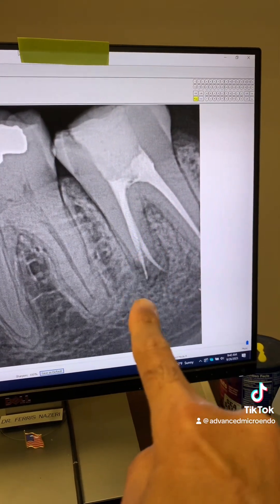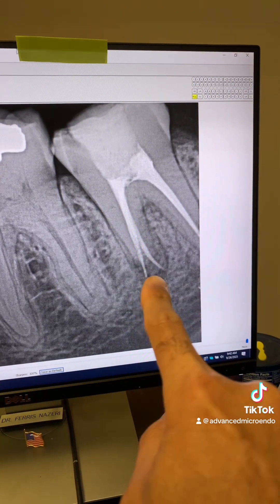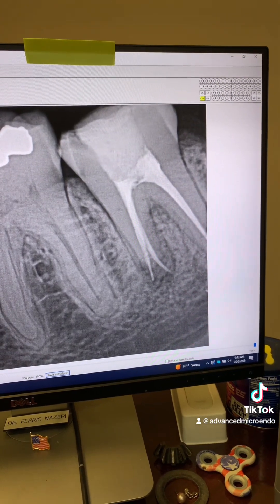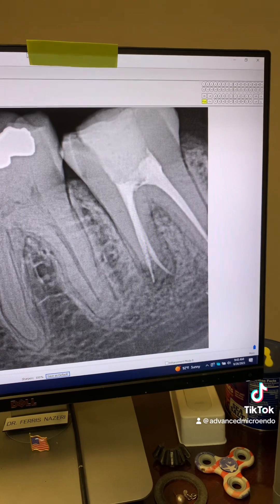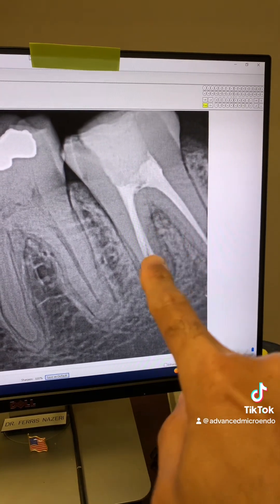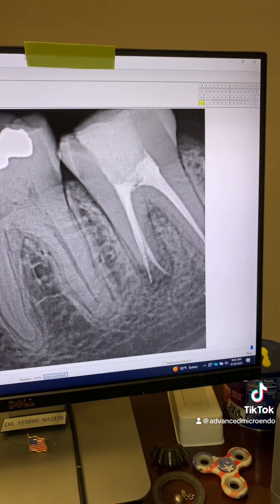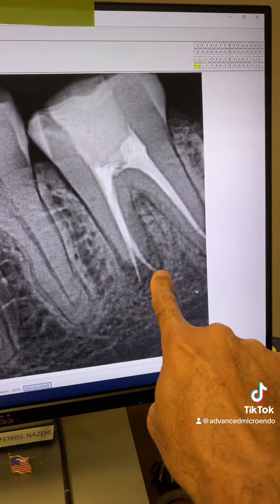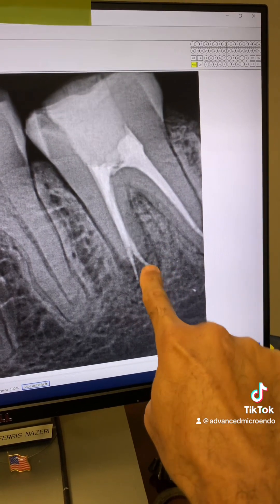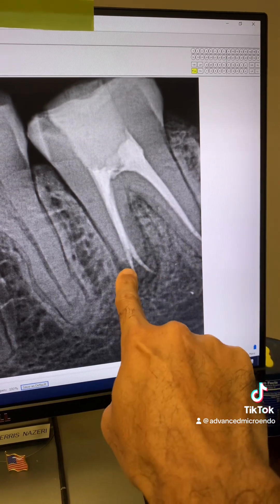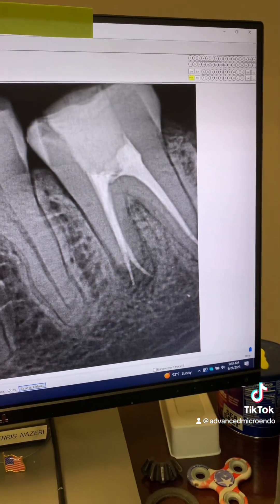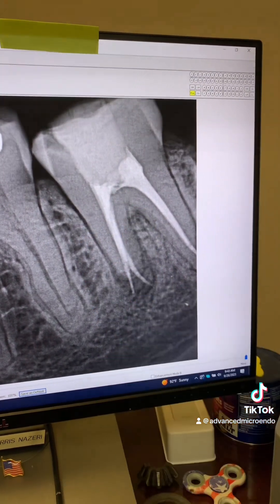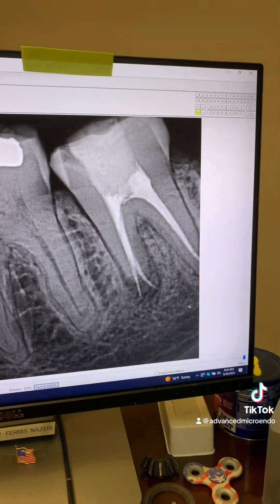Overfilling — filling beyond the working length — doesn't cause an endodontic failure. What does cause an endodontic failure? Bacteria. Bacteria cause endodontic failure. A short fill, a flush fill, an overfill — none of those cause endodontic failure. As you can see, the mesio-buccal is filled to length, and the mesio-lingual is obturated beyond the working length of the canal.